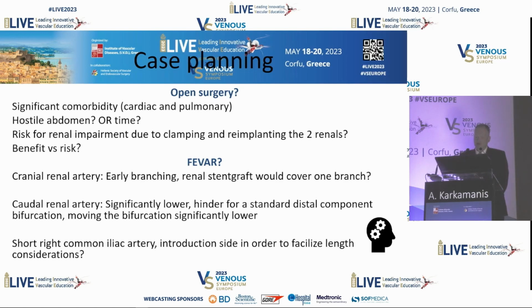The fenestrated solution was not a perfect solution either, because the early branching of the cranial renal artery would require that we cover one of the branches. The patient was not on dialysis. The significant lower renal artery also created a problem because of the working length. Then we also were discussing the introduction side due to the short right common iliac artery.